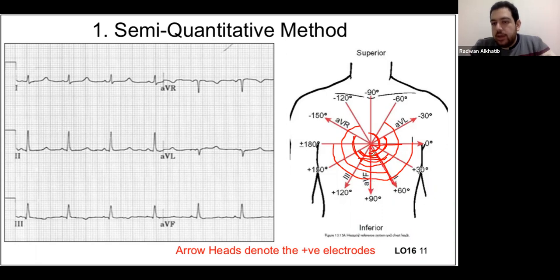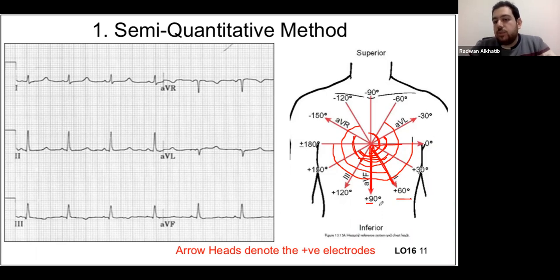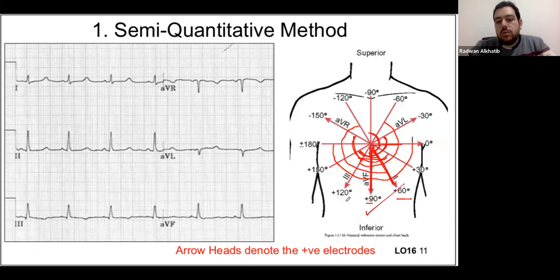After applying the semi-quantitative method, we look at where most lines are overlapping on the graph. In this example the overlap is clearly in one area, indicating the axis is approximately between positive 60 and positive 90 — which is normal, since the normal axis is between zero and positive 90.